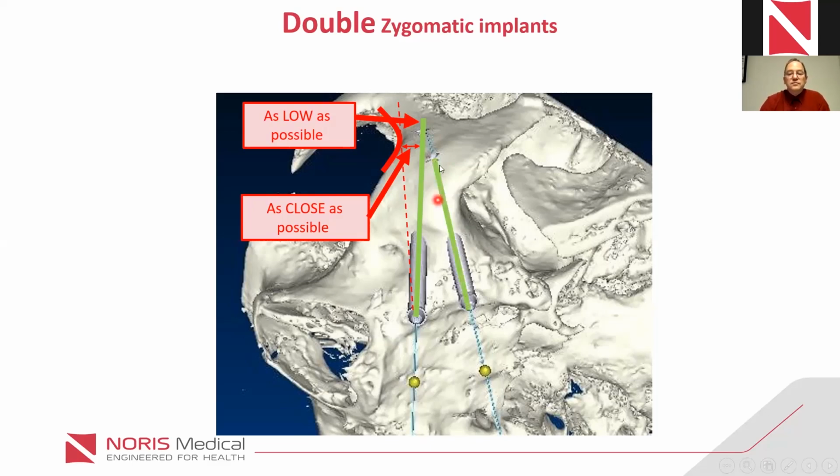Again, for the posterior implant, we need to make sure that we don't fall into the temporal fossa, even though it is okay sometimes. Sometimes there is no other way rather than going this way because there is no bone. So we can go there, but then we are actually injuring the masseter that is anchored here. When we raise the flap, we always see the fibers of the masseter here. So if there is no other way, then it's done. But if we can avoid that, we can avoid that.